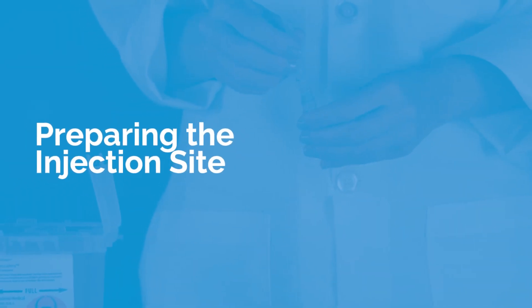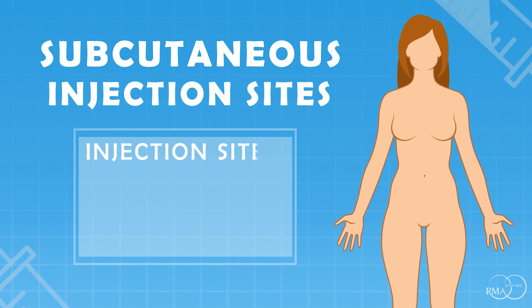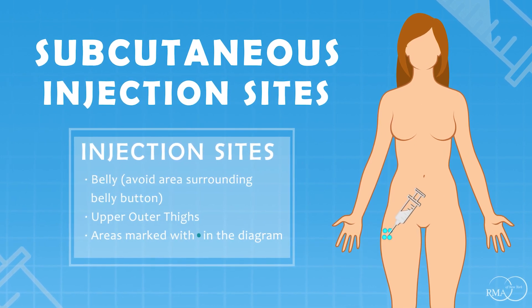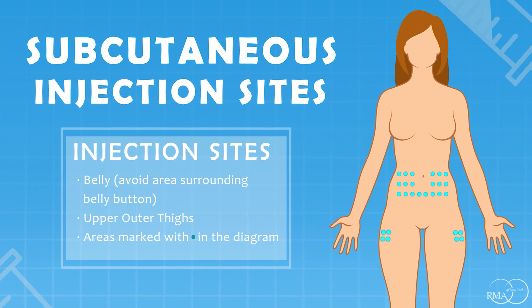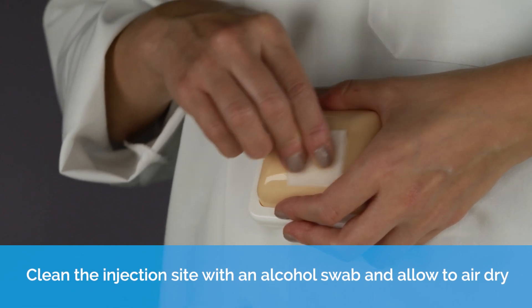Preparing the injection site. Clean the injection site with an alcohol swab and allow to air dry.